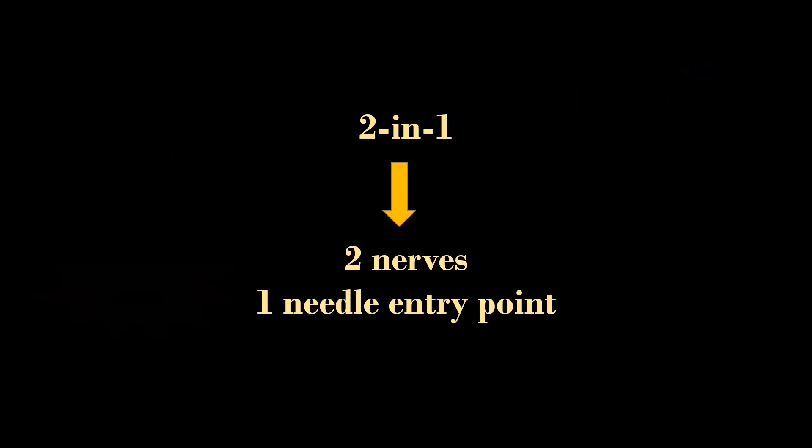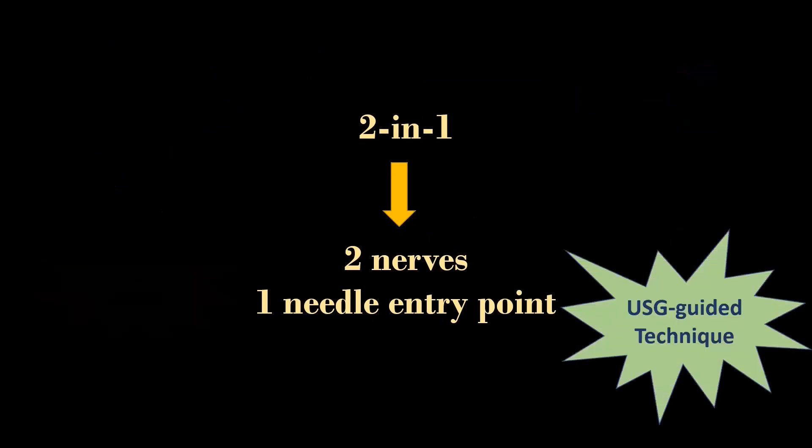I am going to demonstrate the ultrasound guided 2-in-1 block for hip fracture analgesia. Why 2-in-1? Because it has technical and anatomical advantages.